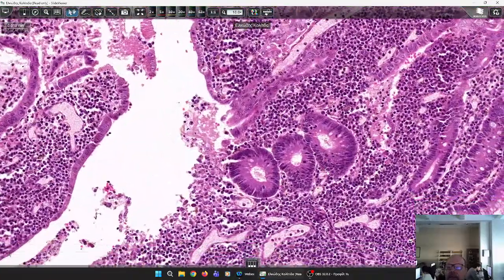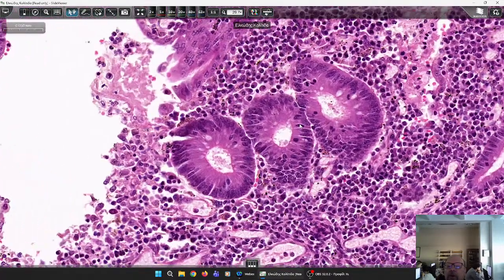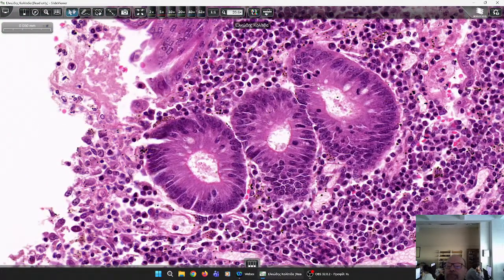And more importantly, something that may lead to prophylactic colectomy is dysplasia. It can be postulated here, however, due to the activity of the inflammation, you are not sure. You see mitosis. You cannot tell if we are up in the lumen, close to the lumen, where mitotic activity is not normal. So you see some sort of pseudostratification. These are indicative features of dysplasia, quite indefinite. So what do you tell the clinician, the gastroenterologist?